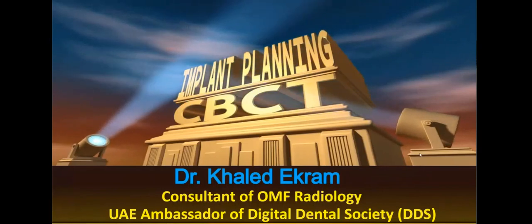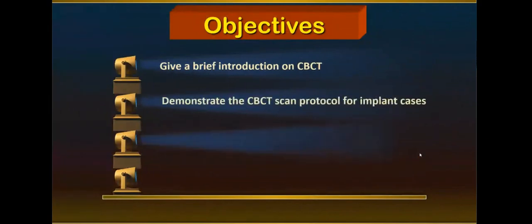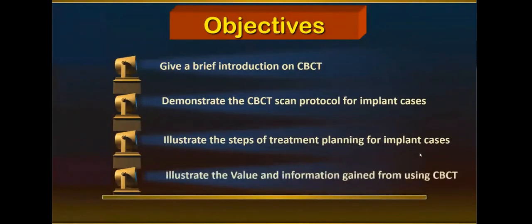First, these are the objectives of our lecture: to give a brief idea about the CBCT, demonstrate the CBCT protocol for implant cases, and illustrate the steps of treatment planning for implant cases, in addition to illustrating the value of the information gained from the CBCT.